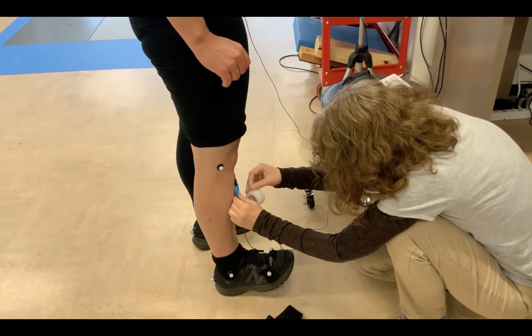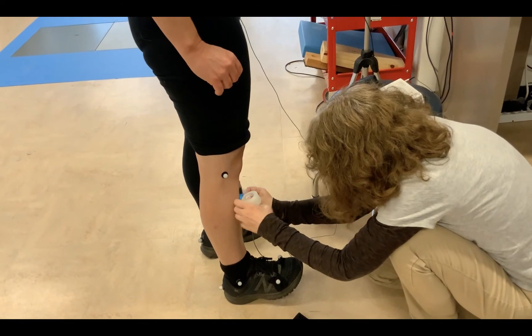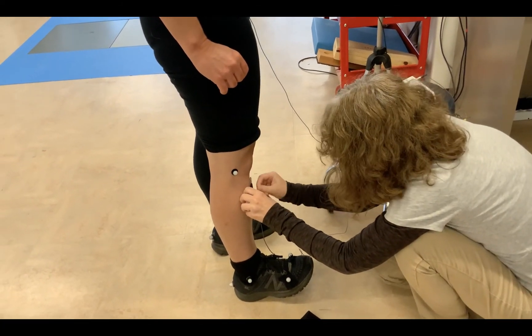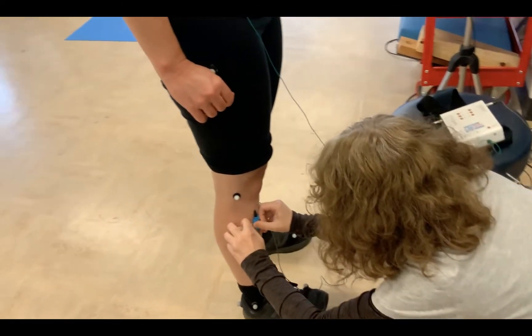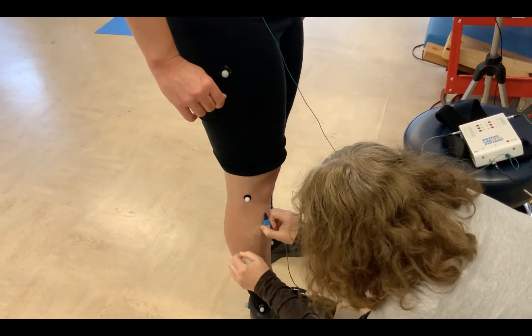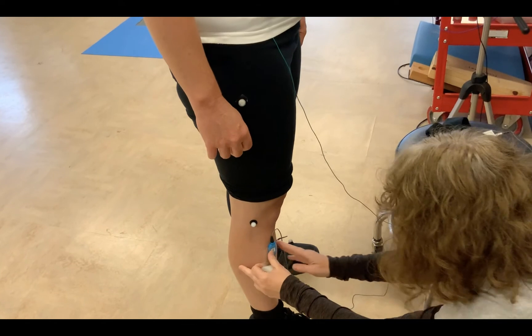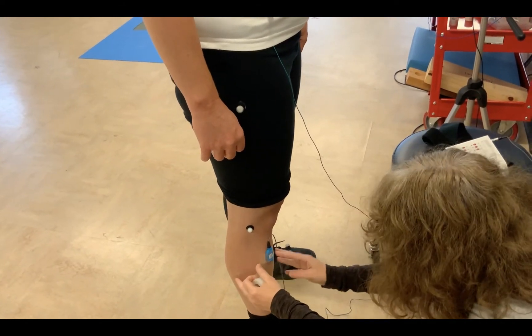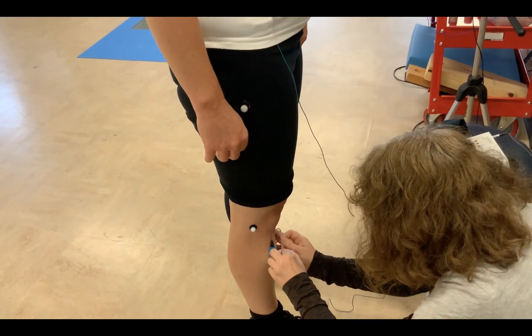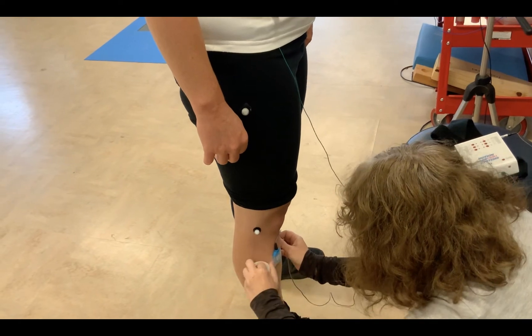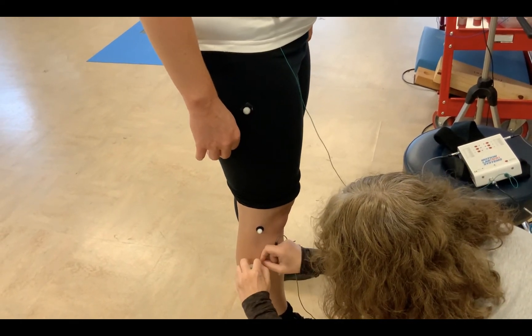You can also do other things. So here's a lower leg and notice how the subject is flexing her toe so that you can really feel the tibialis anterior muscle there. Then the sensor is being placed right on the tibialis anterior muscle belly, taped down securely and really snug, making sure it's aligned carefully.